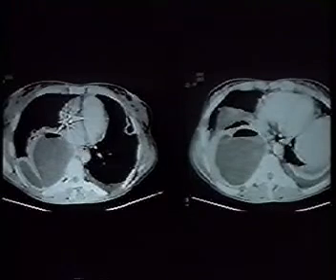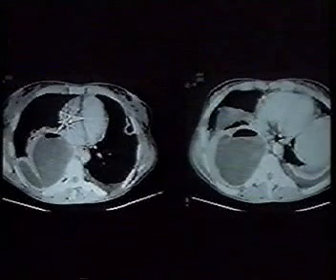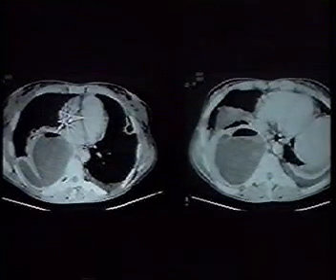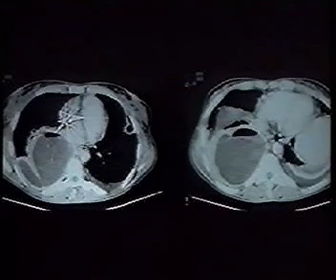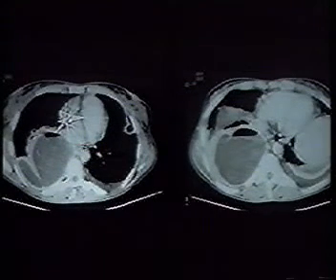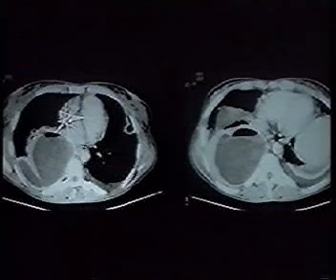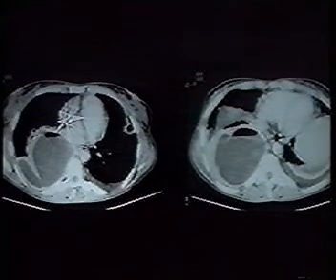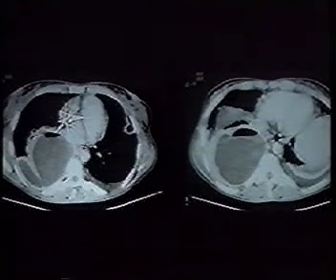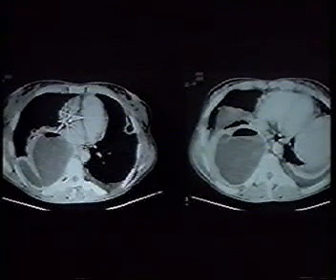And here's the CT scan on this patient, and you can see the patient has a very large fluid collection with what we would term a split pleural sign, indicating that this is a very large air fluid collection in the right pleural space. You'll notice how it conforms to the chest wall, how it causes compressive or passive atelectasis of the underlying lung, and lower down, similar findings, a large air fluid level in what represents a hydropneumothorax or pyopneumothorax in this patient.